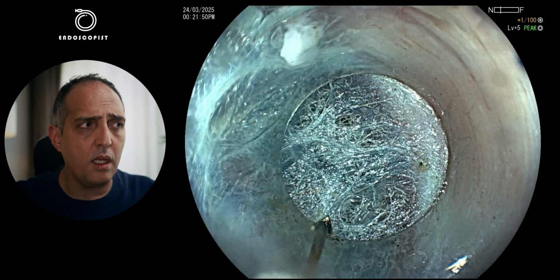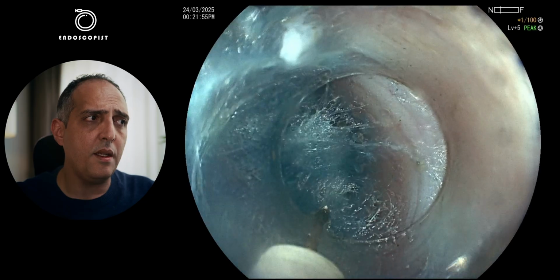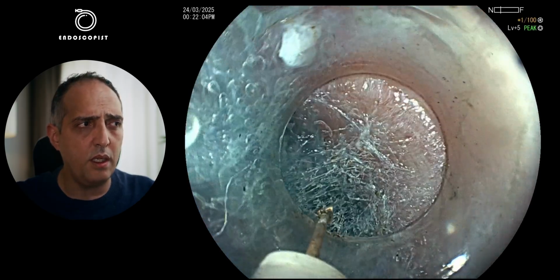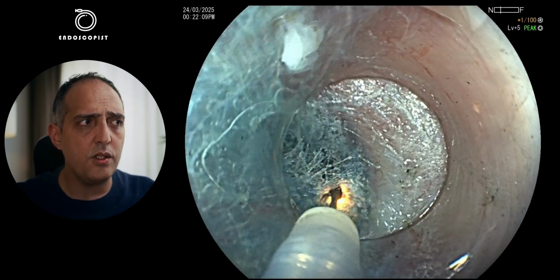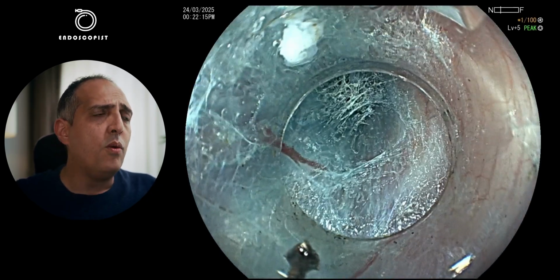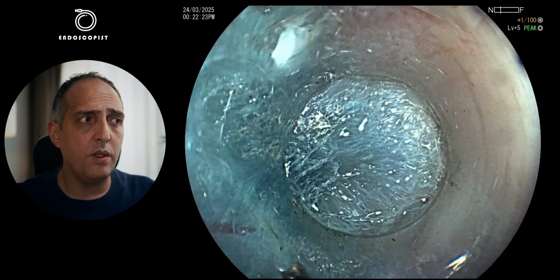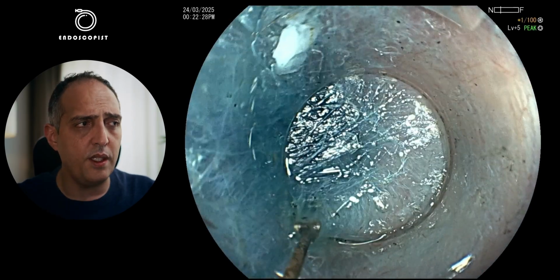Again, it is a collaboration between mechanical tunneling and minimal spray coagulation. I believe myself that the smaller the tunnel, the faster it will heal. And again, it is less coagulation, less mediastinitis, less possibility to hit a vessel or something. When we face any vessel like this, we'll just inject, and with the spray coagulation, usually we'll be able to coagulate the vessel without any bleeding. So I push, I penetrate the submucosa, I inject whenever it is needed.